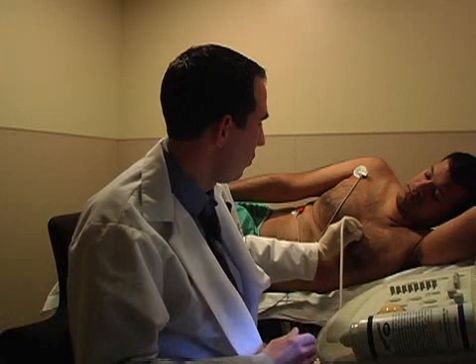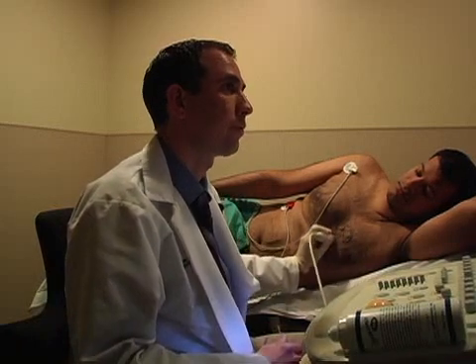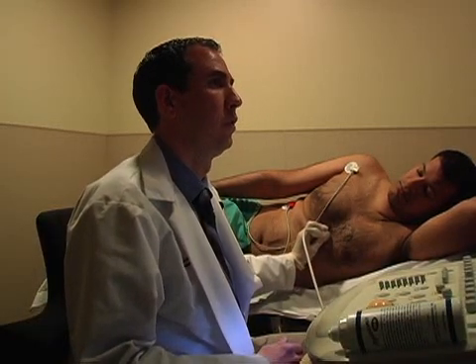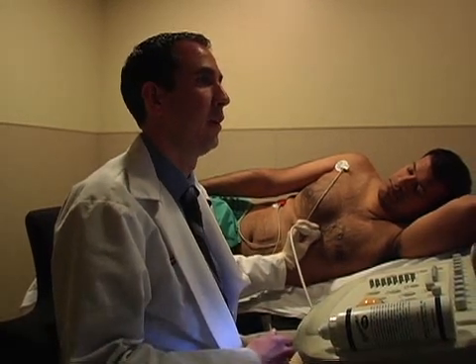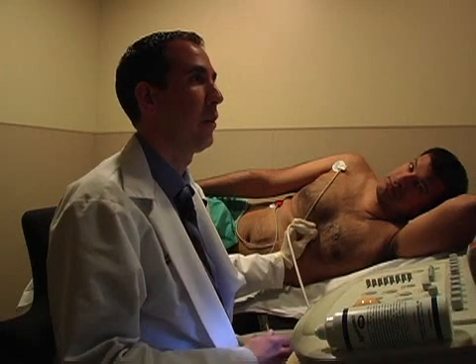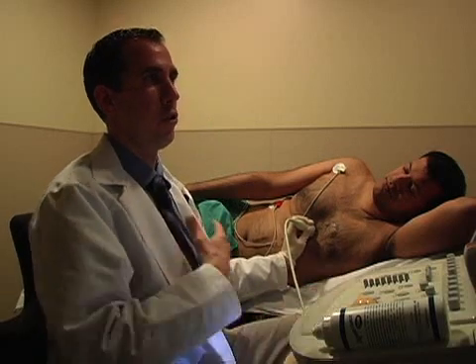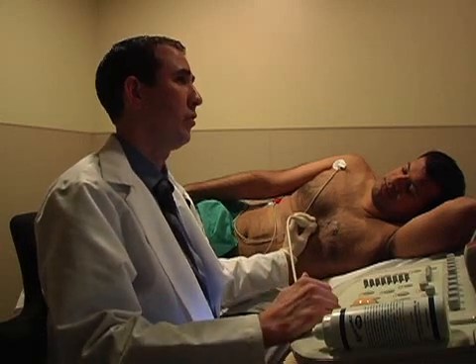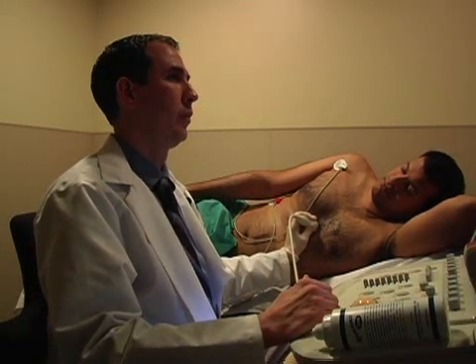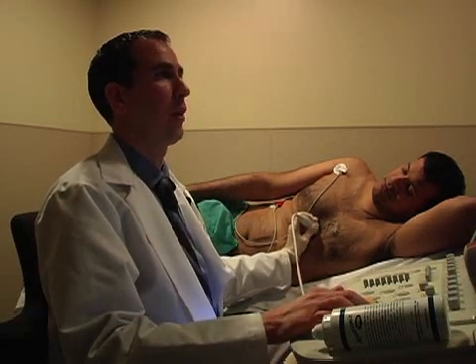For the parasternal long axis view, start at the left sternal border, about the fourth intercostal space. You always want to move around — don't grab the first picture you get. I kind of like to start high and work my way down, but you don't want the highest or the lowest image. Sometimes in the parasternal views, because you're imaging around the lungs, a deep breath in will help. Take a deep breath in, blow it all the way out, and then the patient holds their breath out. Sometimes the image will become a little bit clearer, and this is where you want to move around and optimize.